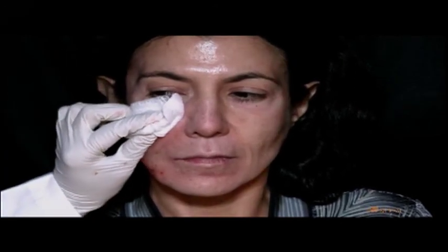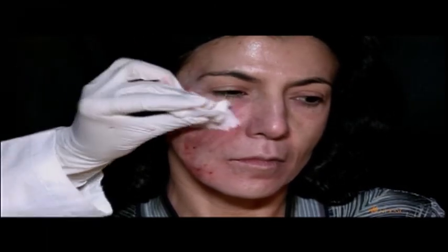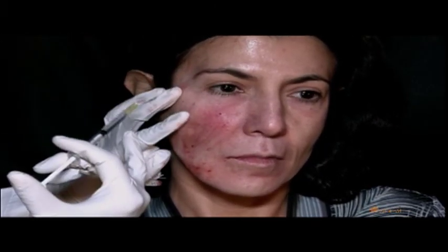Go ahead. We're going to be, if you come back for the demonstrations tomorrow morning, we will take a look at Xeomin injection. Basically, the number of units for that is going to be exactly the same as for Botox. So for instance, around the crow's feet area, if I were to be injecting 4 units of Botox at each site, I would simply do 4 units of Xeomin at each injection point. And that's what I'm going to do now. Go ahead and smile.